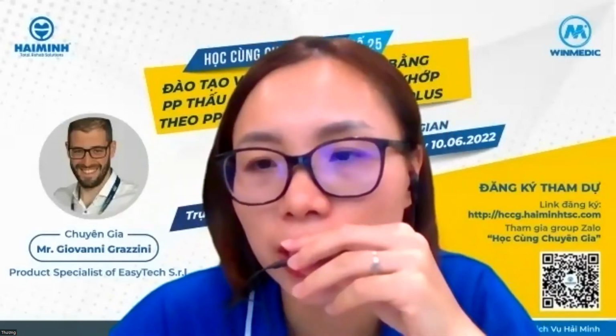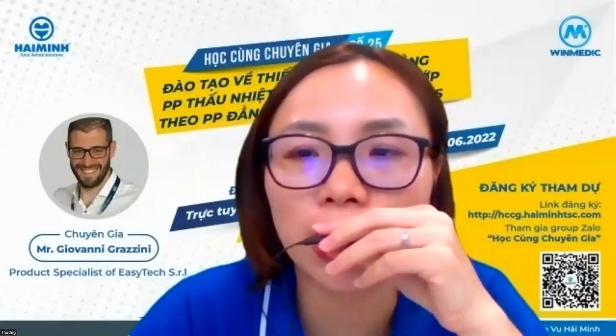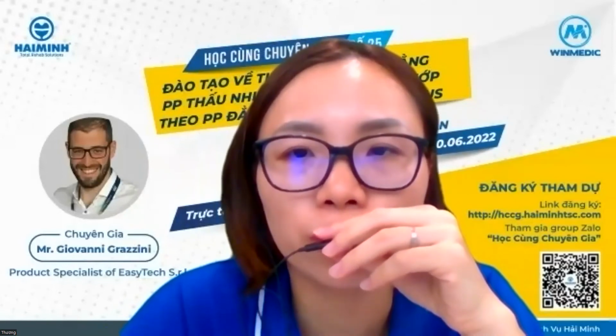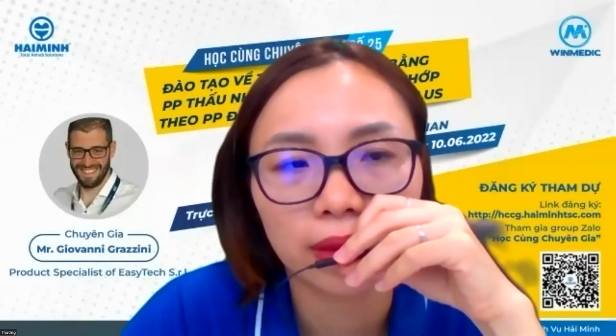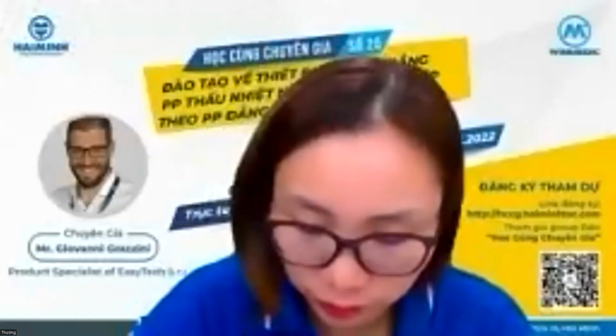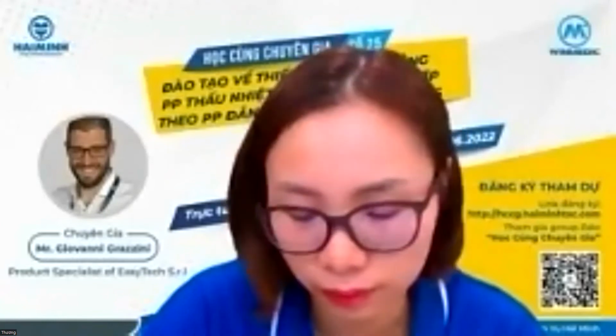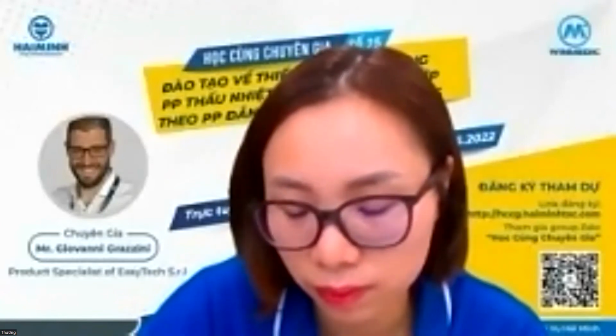The following question is for some acute pathology, is it possible to use Nova? Acute pathology? Let's say you have to wait at least 48 hours from the trauma.